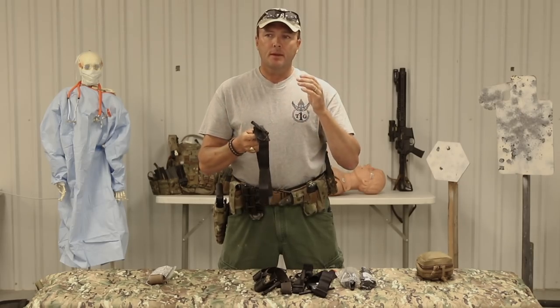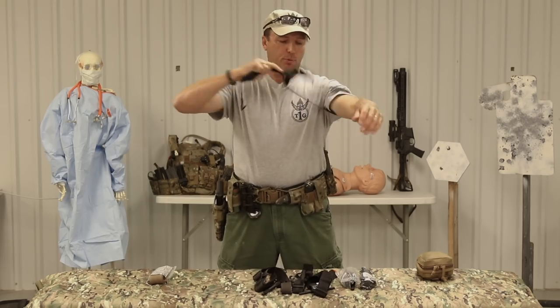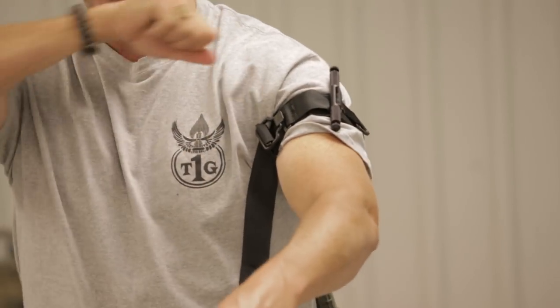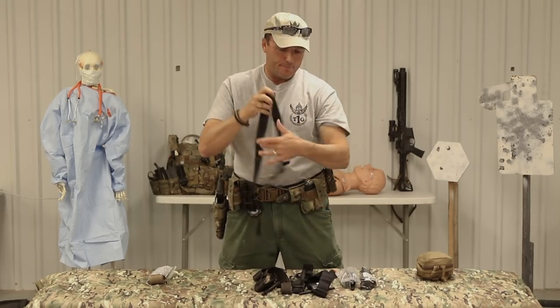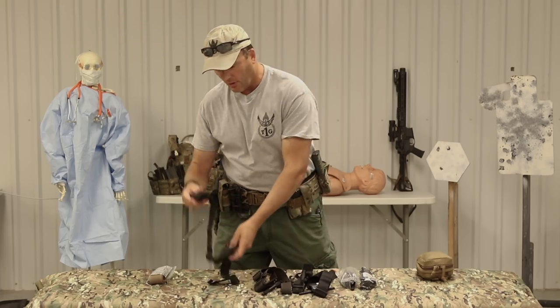For treating someone else - another casualty - this is, in my personal opinion, the best tourniquet out right now: the SOF-T Wide. As far as self-treatment, it's much harder to pull that thing tight. I have to really keep working it to get it down tight - notice how that took four or five ratchets, where I didn't have that problem with the CAT-T. Treating yourself, stick with the CAT-T. If using it on somebody else, use the SOF-T Wide. There are differences between the two - they're not just knockoffs of each other.